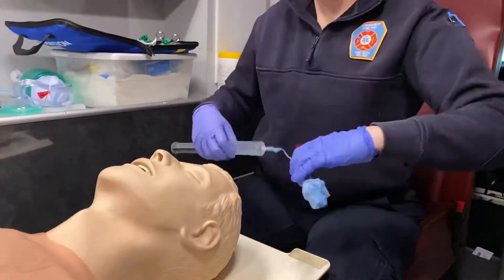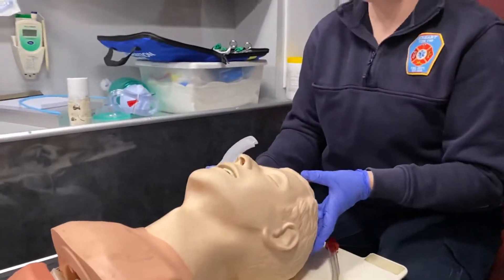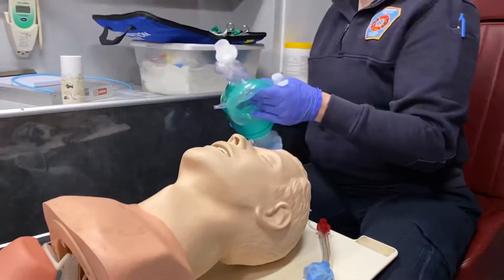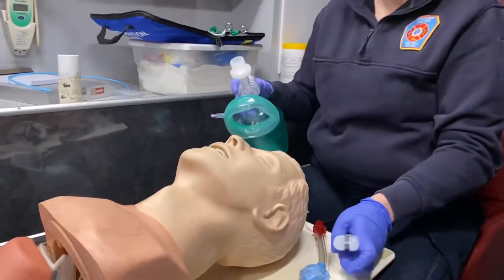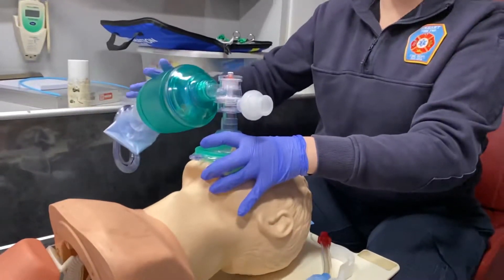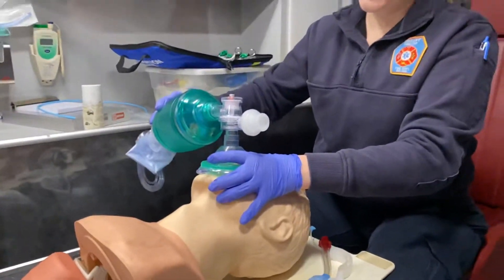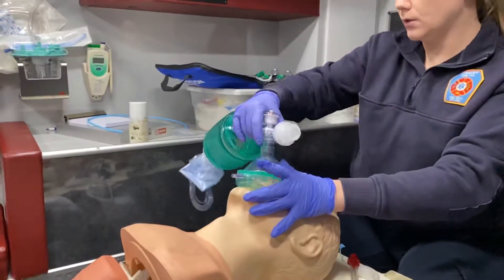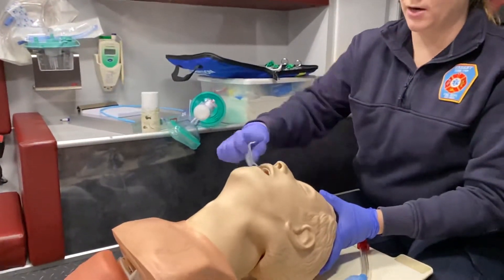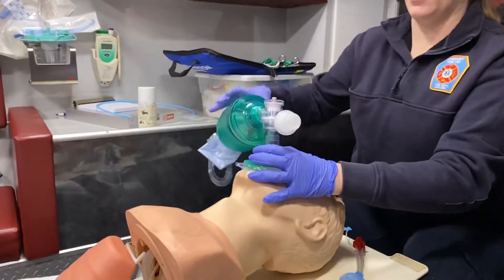So we start with our patient. Our patient is unresponsive — they're not breathing, but they do have a pulse. We want to start with BVM ventilation at 15 liters per minute, 100% oxygen. Remember to make sure you have a good EC clamp. Bag at a rate of one breath every five to six seconds, and make sure you're counting out loud so you're not over-bagging your patient. We can also insert an oral airway to maintain a better airway and keep it open.